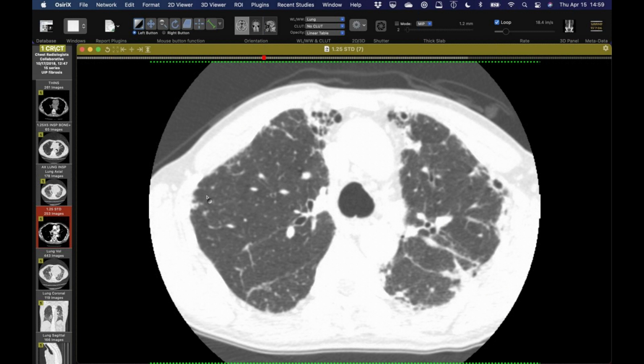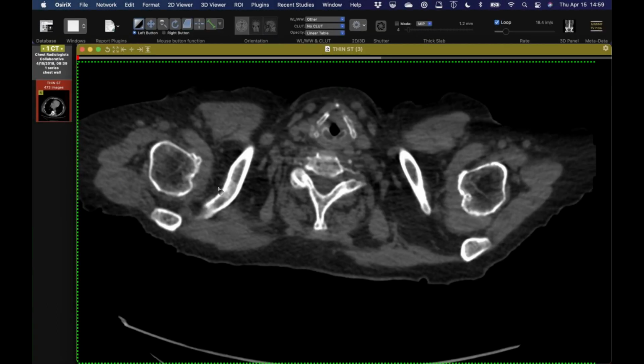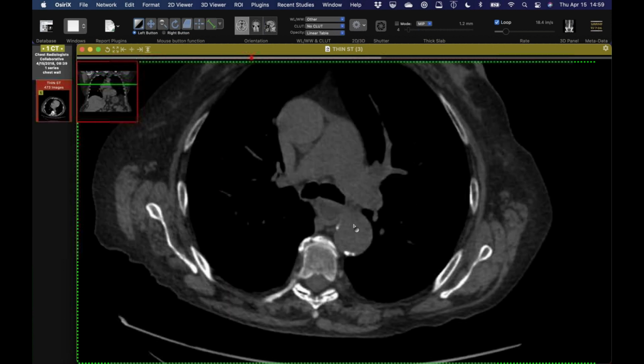Jeff, what's the interval between the earlier CT you showed and this one? About 2 years. Just 2 years. Yeah. So that's fairly rapid progression. Right, and he presented with advanced disease as it was. Yeah. I think it's probably going to be RA of some kind. Yeah, although the anti-CCP is normal, so that's a big hit against RA. But it may fall in this IPAF bucket, having some serologic abnormalities.